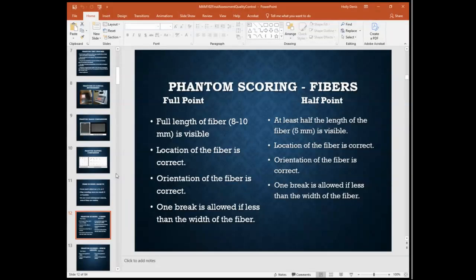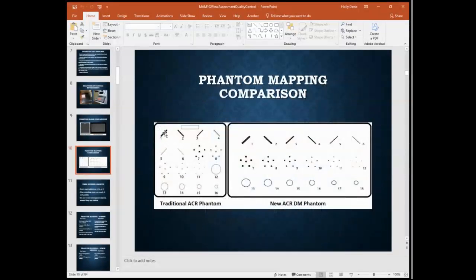And we're going to look again, because, well, I'll go back up to this one, see how the fibers are different widths. So you have this really dense one, and then they get less and less dense until they get really hard to visualize. So if there's a break, it could be a little bit of a bigger break on this, because this one's thicker, whereas on this, the break would just be the width of that fiber, which is so tiny.